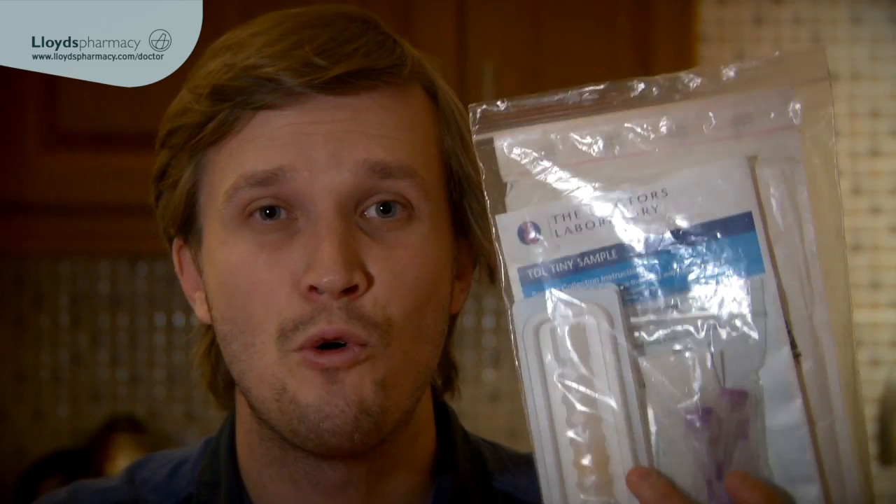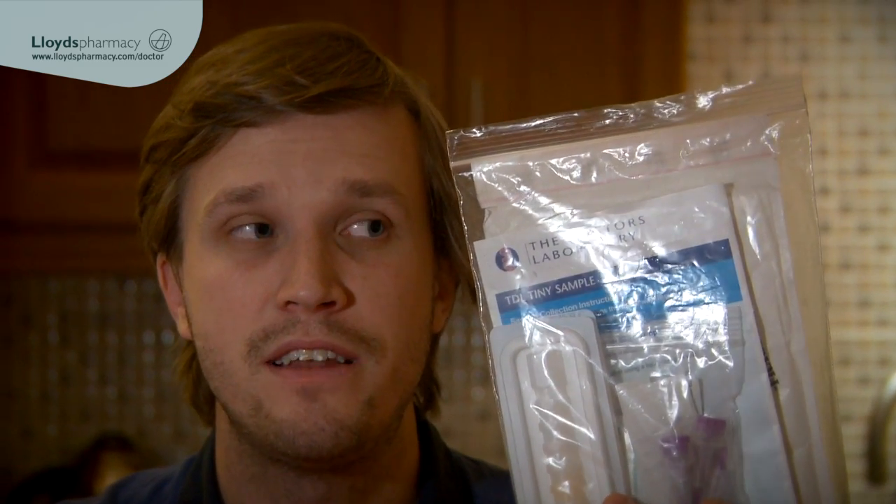I've just received my home blood test kit from Dr. Tom. I'm not keen on needles or blood, but they've told me it's really easy and it's not going to hurt. So let's see what's in this.